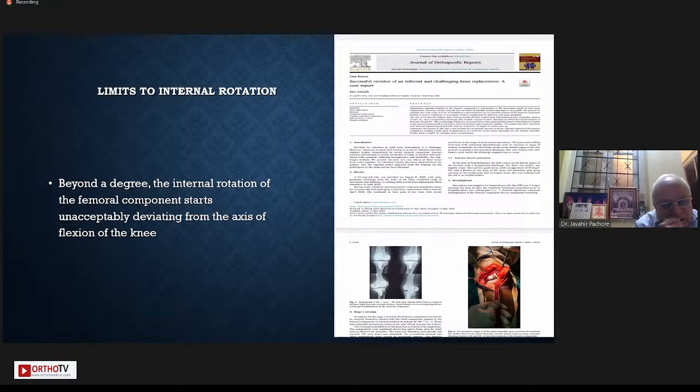The idea of 3 degrees varus was Ranawat's. He came to Mumbai to show the surgery. And he is the only person, during that time in the 90s, who had two tibial alignment jigs. One was 3 degrees varus, the other was neutral. And to our surprise, the knees that went into varus failed. That was a different story because the implants were different at that time. So Dan Berry's and Merrill Ritter's papers you have to take very seriously, because the population was totally different.